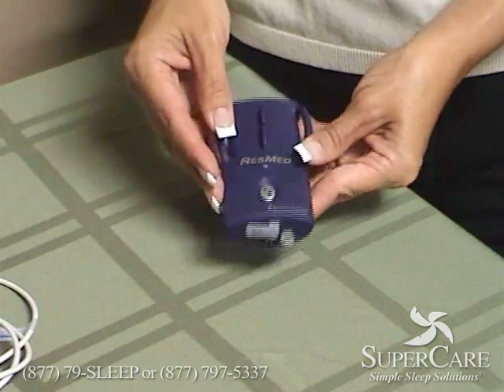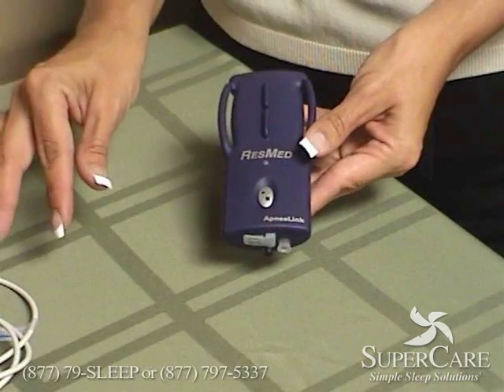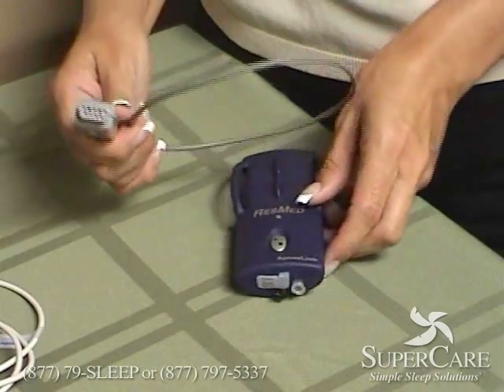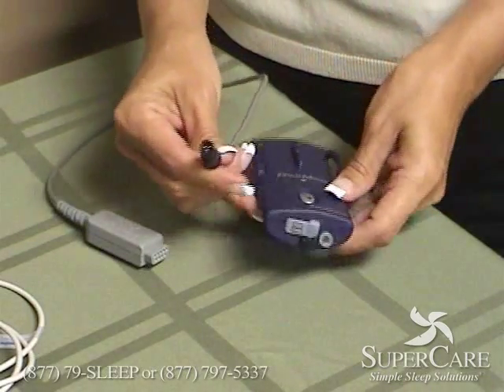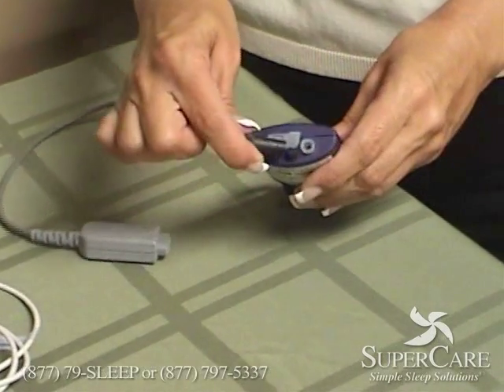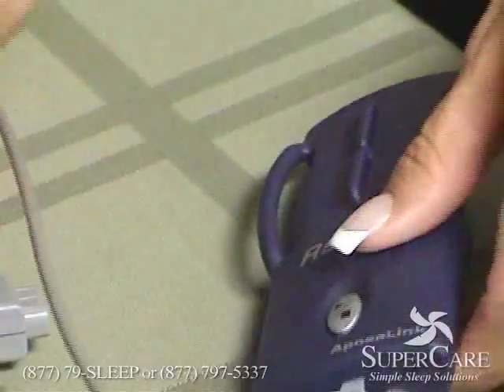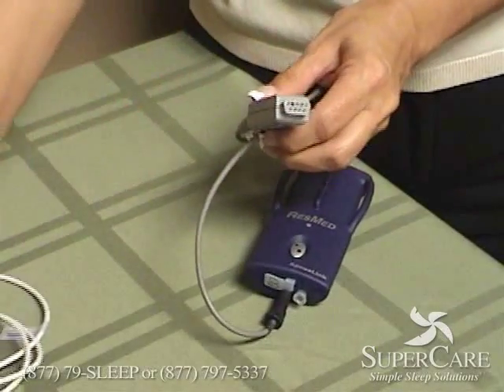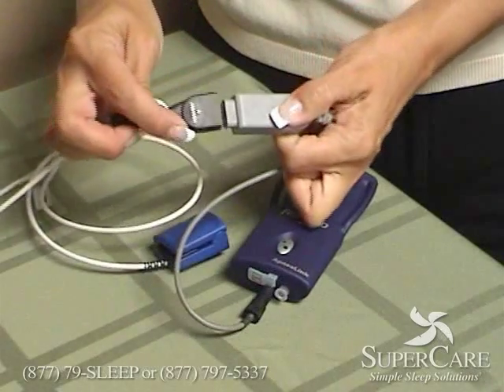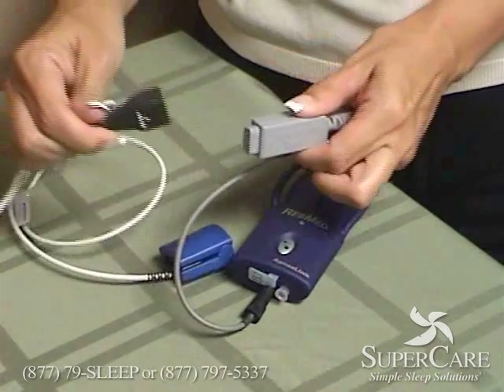To assemble the apnea link, if there is a plastic cap right here, go ahead and unscrew it and put it back in the container. Take the gray connector — the black part of the connector is notched and it fits over the black knob at the bottom of the apnea link. The other end of the connector is going to attach to the finger probe. It slides on just like that and it can only go on one way.